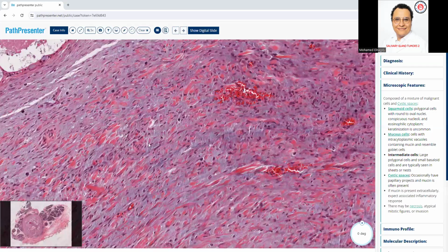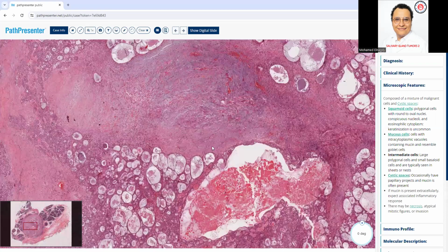But I know which one you are talking about. You are talking about this area, right? I'm not seeing the screen. Oh, you're not. Oh, sorry. I closed the share screen. I'm sorry, that's my fault. Here, you're talking about this area, right? Yes, this area.